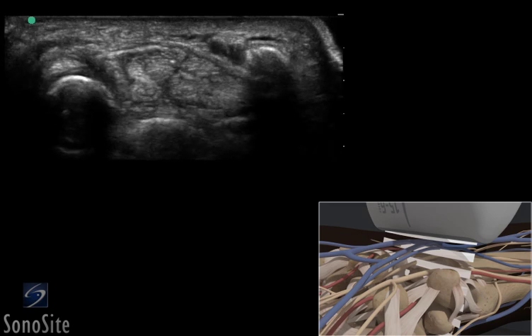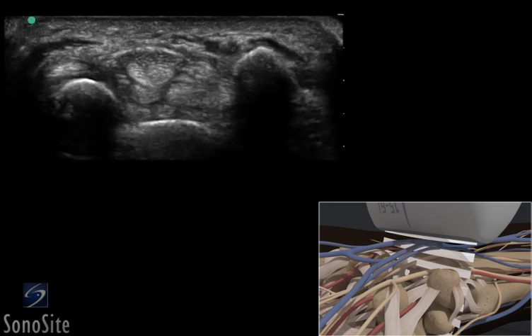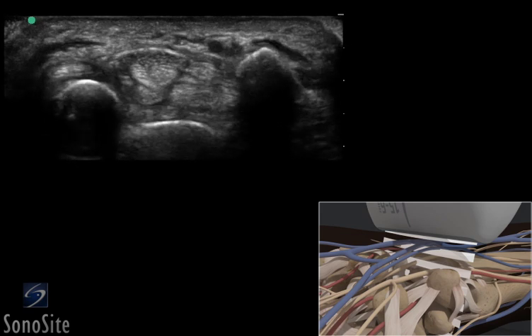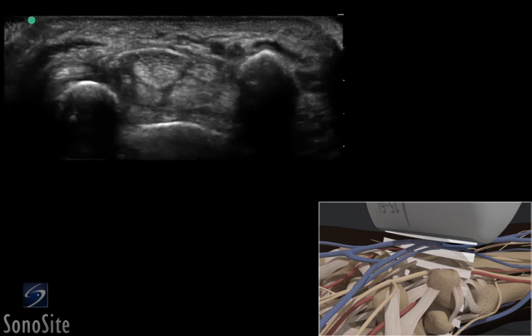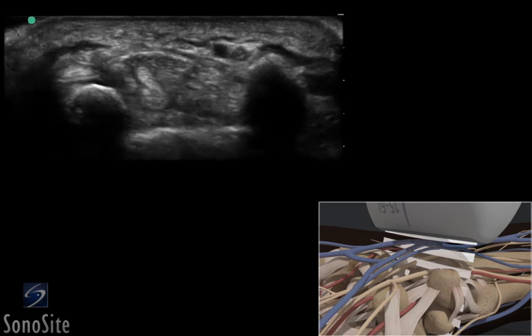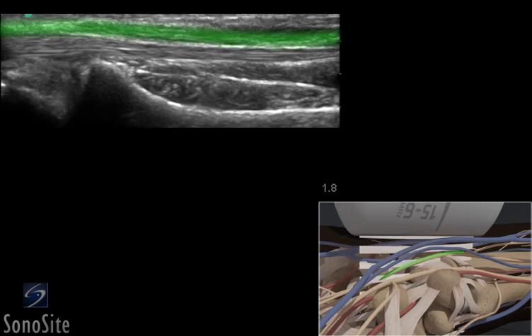The nerve can be distinguished from the tendons by the fact it is less subject to anisotropy and it remains in constant position with transducer translation. The nerve should remain a constant diameter with movement of the transducer distally in the hand. The transducer should be centered over the median nerve and rotated 90 degrees clockwise, at which point the median nerve will appear as a fascicular structure which lies on top of the similar appearing flexor tendons.